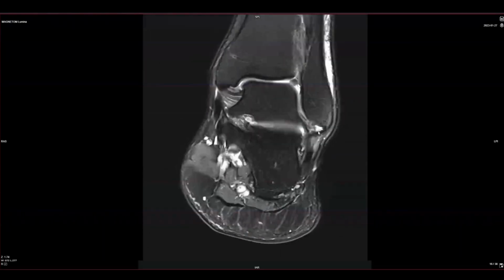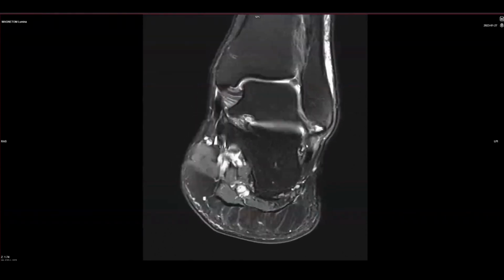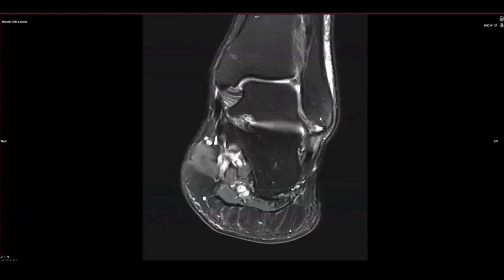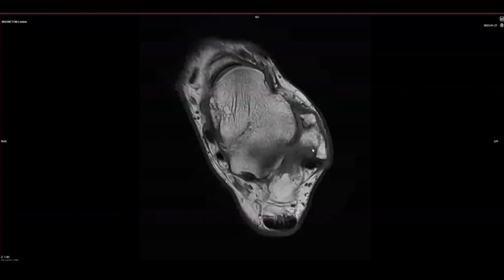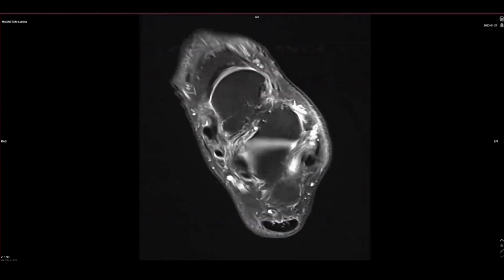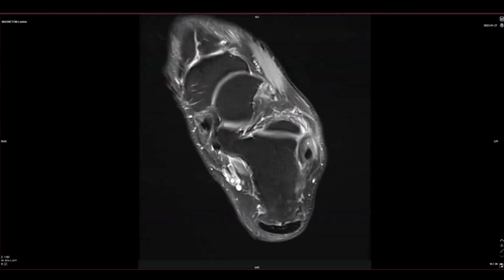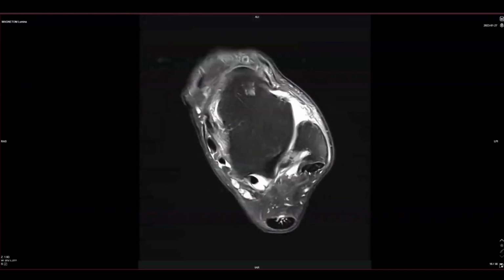And this is a setup for a problem for this patient because they have this os fibulare that appears unstable. There's quite a bit of synovitis around it. We have the calcaneofibular ligament, which is around the peroneal tendons, and this entire complex is connected through where they attach on the inner aspect of the distal fibula. So we even have some bands of the posterior talofibular ligament coming in front of this region, and because of the degree of synovitis, there's a certain amount of rubbing that these tendons are doing against the ligaments and the bony structures, and that is leading to a greater degree of peroneus brevis pathology, or lateral hindfoot overloading forces is what I should say.